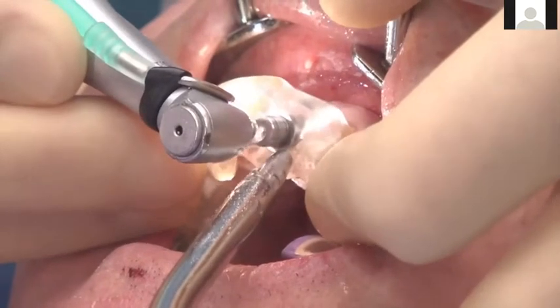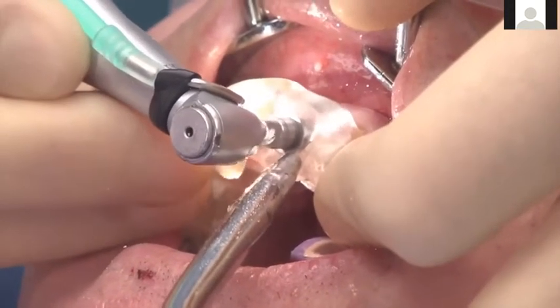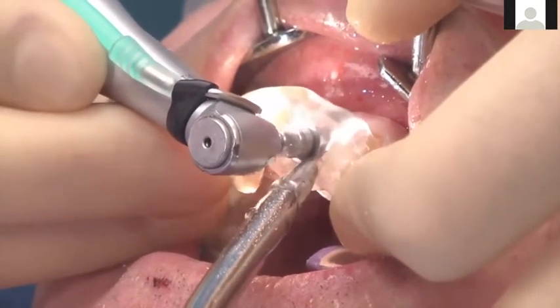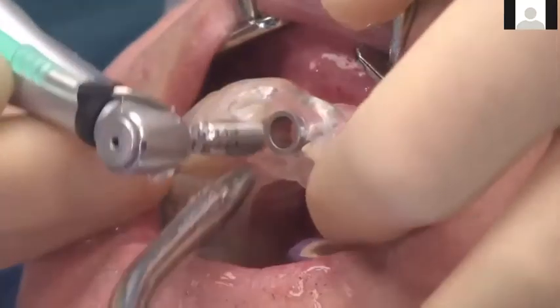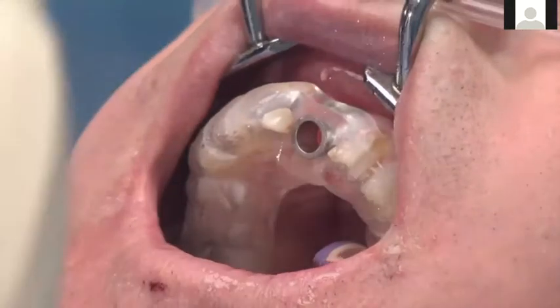So the first step, once we put this OptiGuide on, is to do a guided punch, which we can do with the Straumann guided punch. Here you can see it's fully guided. Most systems do have this guided punch, and obviously do that with copious irrigation. Make sure you go all the way to bone.